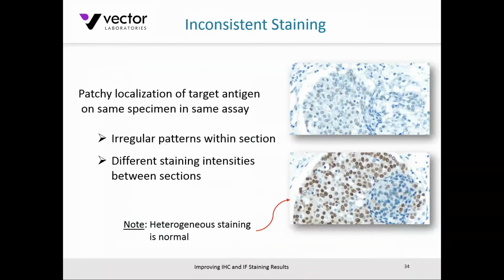All right, so let's close out the webinar here with a bit of a discussion on inconsistent staining. And what do I mean by that? I don't mean that your staining works on a Monday and not on a Tuesday. If that's the case, then please go back and revisit what we just mentioned about absence of staining and the need for these positive controls in place. But what I'm referring to here is a patchy localization of the target antigen on the same specimen in the same assay. So imagine these two particular images I've got here.